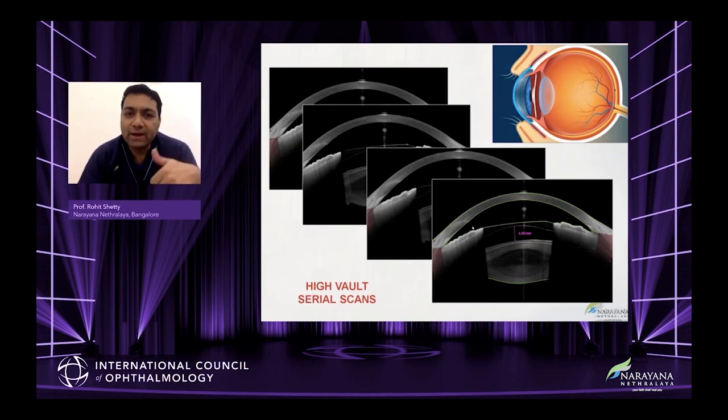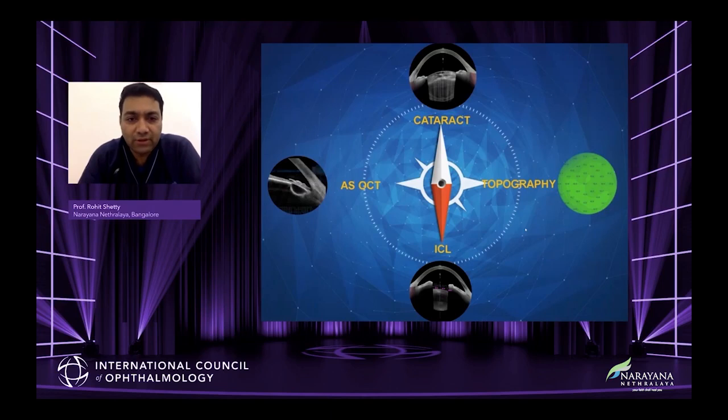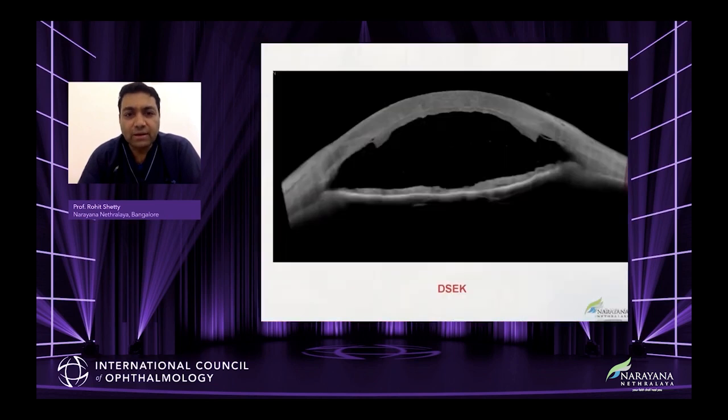So not only for cataract, it has a huge role in phakic lens surgery. In today's context, phakic lenses are used very commonly, in patients who are not suitable, and many times it's the first line of surgical procedures for a refractive surgeon. Again, comparison is the thief of joy, but still, we had to compare. We compared this with one of the best modalities of anterior segment imaging, CASIA, and you can see that the vault is more or less the same between both the scans. And finally, coming to the role of this as an anterior segment tool, you can see the DSAEK images.